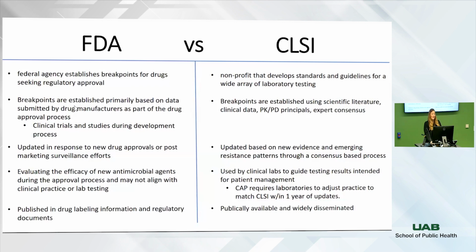All right, and then the FDA, their data is kind of hard to find. You have to dig through their website, but CLSI is very publicly available and widely disseminated. If you actually Google CLSI free, it'll bring up a list of some of the most routinely accessed CLSI documents.